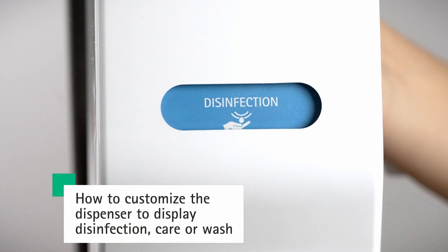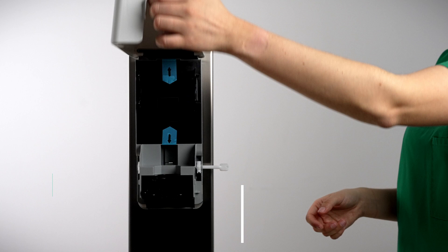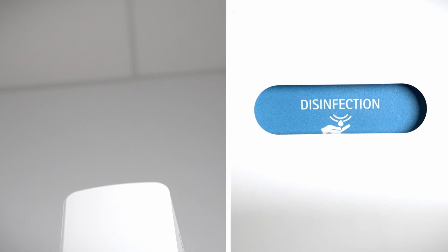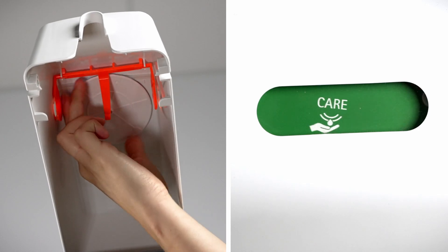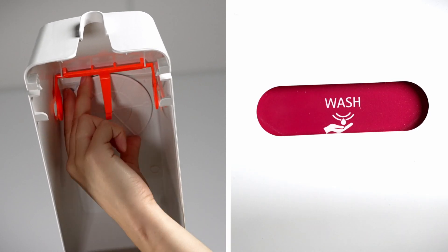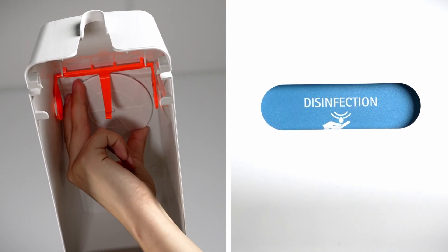The product dial shows the product that is inside the wall dispenser. To locate the adjustable rotary disc indicator, open the dispenser cover as explained in step 1. Locate the rotary disc on the inside of the cover, lift the wheel slightly and turn it clockwise to display the required product.